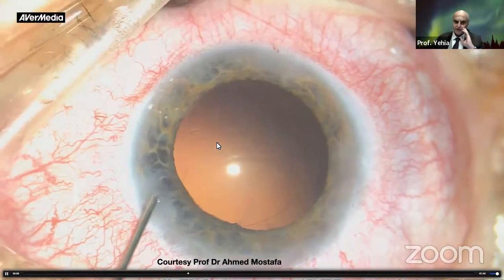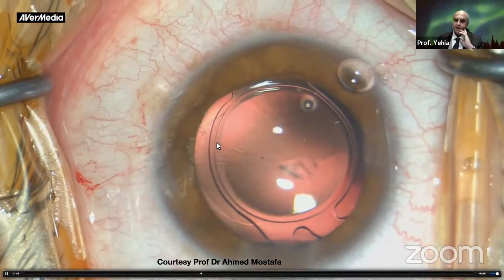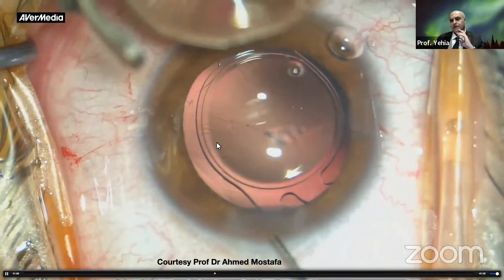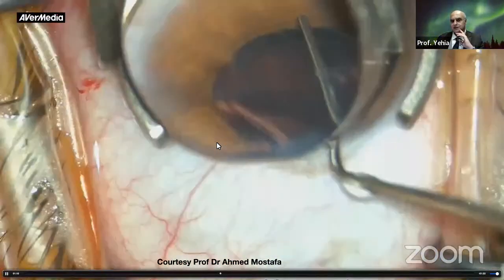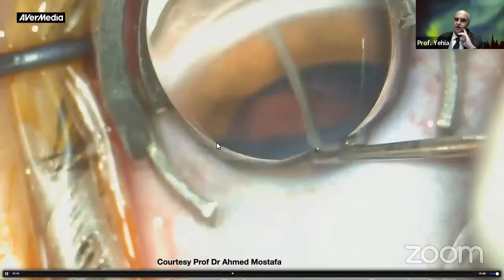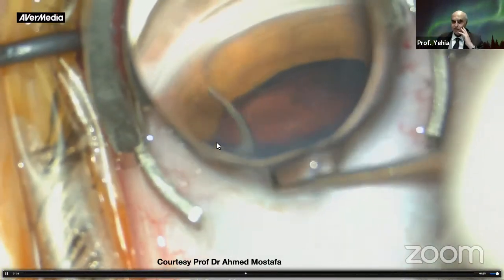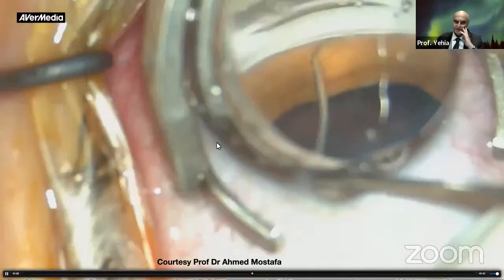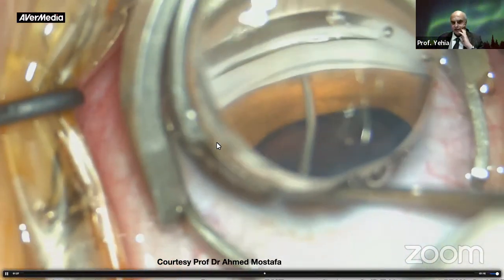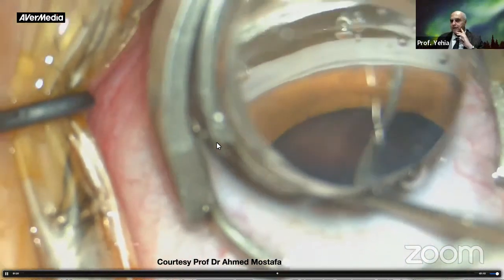After doing the phacoemulsification, injection of the intraocular lens, then you can put the direct gonioscope and you'll see the synechia. Instead of what I did previously blindly, here you can do it under clear vision. But if you don't have it, you can do the technique I used in the previous surgery. Now I got this lens, so I use this lens as well. You can obviously see under vision, dissecting and opening the angle.